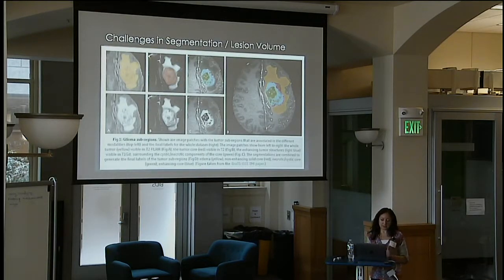Most of you probably saw Peter Chang's demo on Wednesday afternoon on the challenges in segmentation and lesion volume. Every year there is a challenge known as the BRATS challenge for segmenting brain tumor lesions based on the T2 and T1 weighted pre and post-gad anatomical imaging.